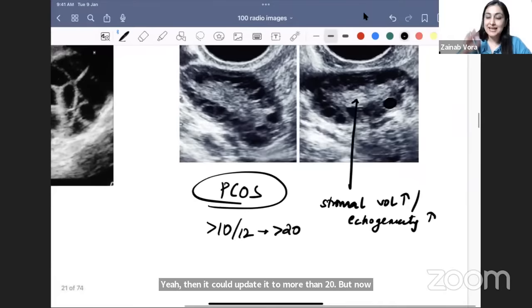Rotterdam criteria for PCOS: two out of three must be positive — ultrasound features (multiple peripheral follicles with increased stromal echogenicity), biochemical markers (raised LH and testosterone), and clinical history. If you see the ultrasound features plus the history, you can diagnose PCOS without biochemical markers.